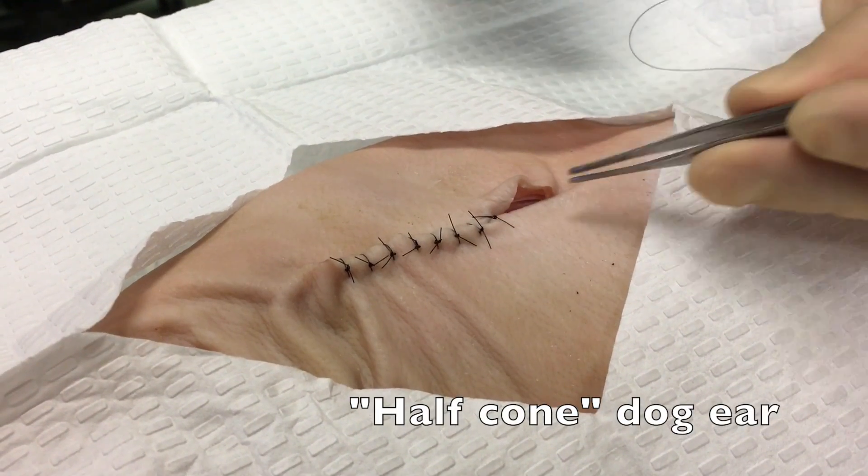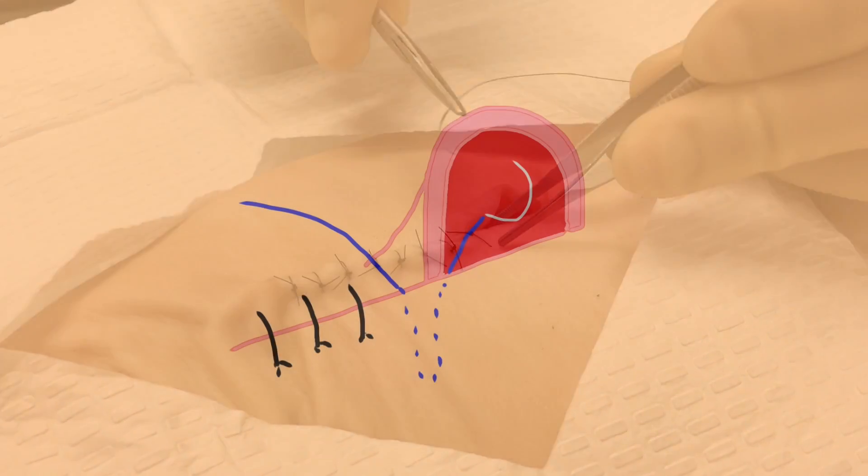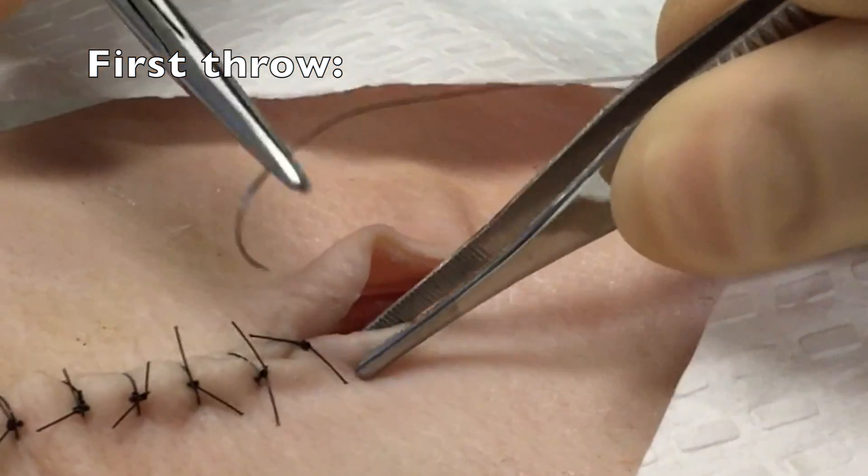The first step in correction of the half cone dog ear — meaning a dog ear which only flopped over to one side, a more commonly encountered problem in emergency medicine — is to place a throw that runs in line with the wound, that goes deep into the fascial planes, and then exits right at the point where the dog ear begins.